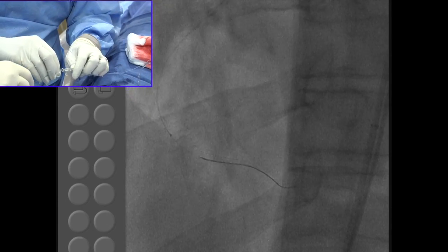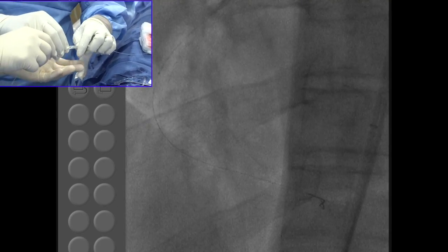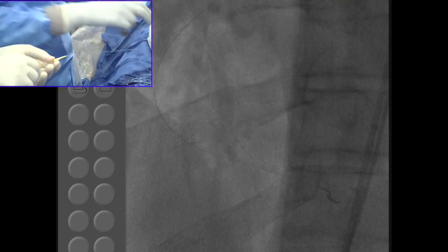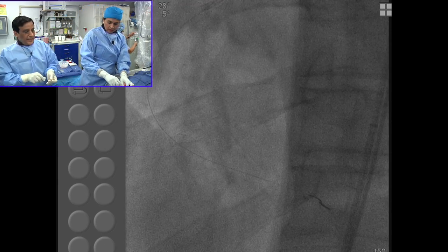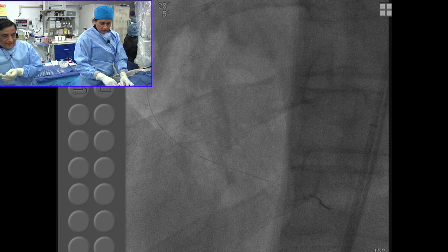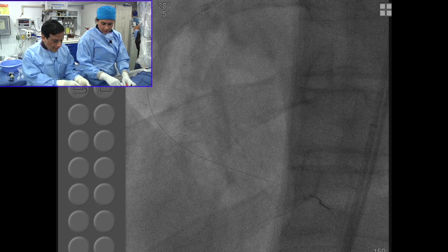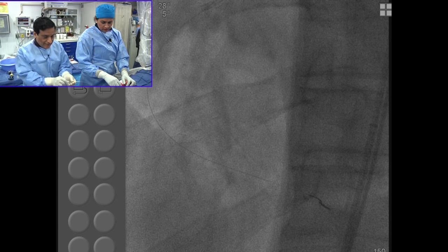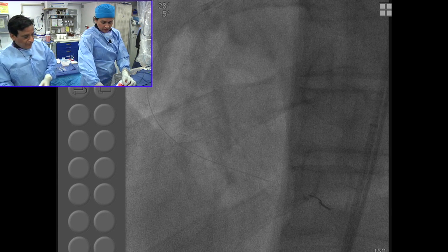Yeah. Sameen, a couple of follow-up questions. Where do you think we are going to be using the BVS, for every patient? Well, what we learned, and it's very interesting, till we get better data, is that after this BVS data were presented, I got a call or SMS from a few people. Some said that if they have a lesion in their vessel, they still go with the Xience, or some said, well, we'll go with the BVS because of less angina.